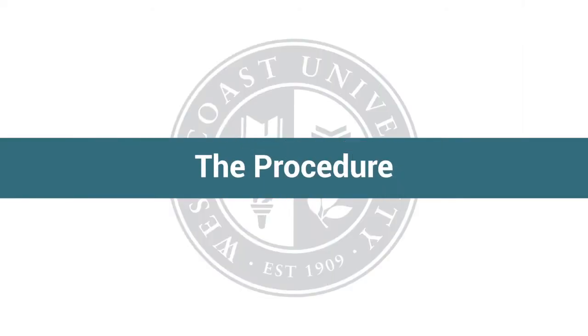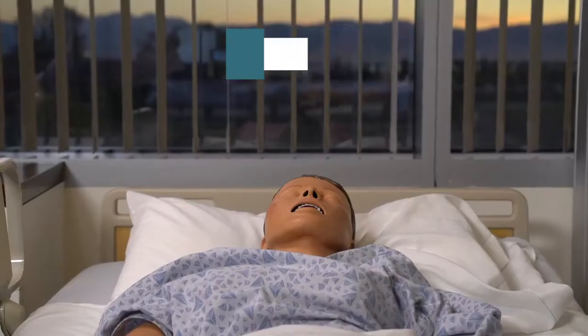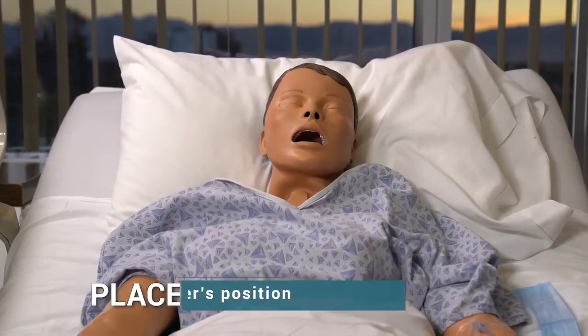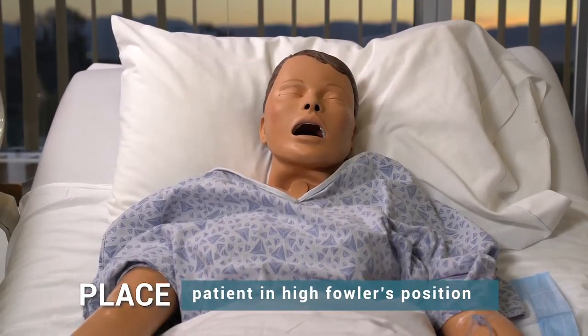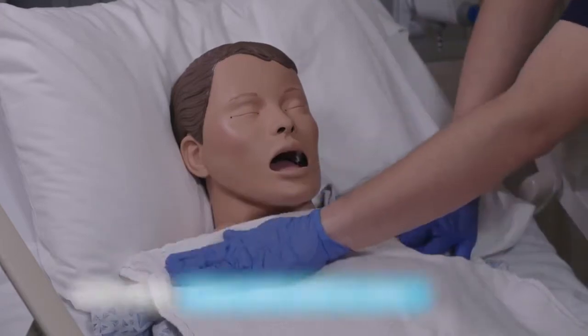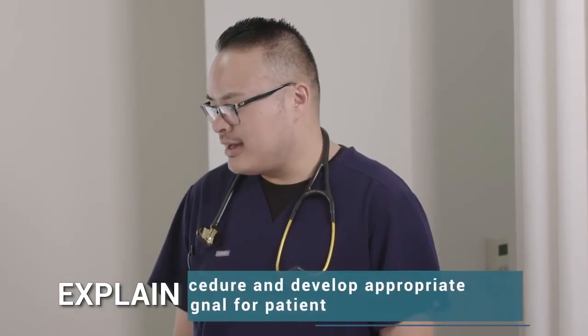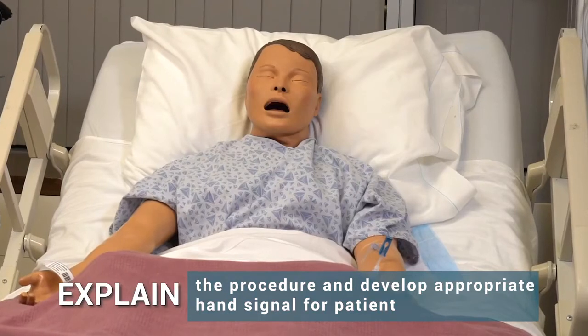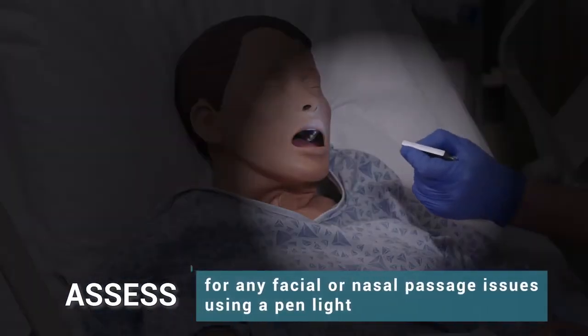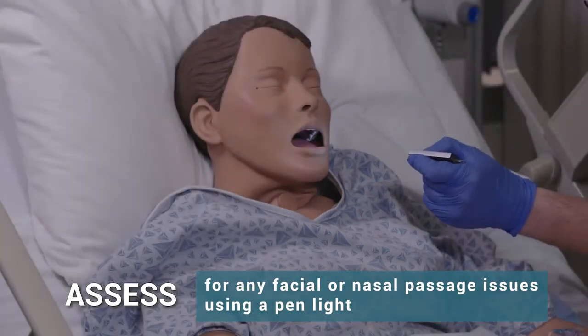The procedure. Perform a GI assessment, assessing need for nasogastric tube placement. Place patient in High Fowler's position and cover chest with towel or chucks. Explain the procedure and develop an appropriate hand signal for the patient. Using a pen light, assess for any facial or nasal passage issues contraindicated for this procedure.